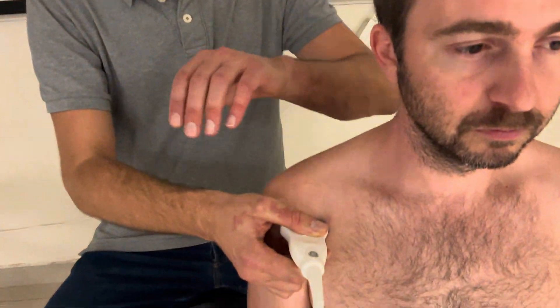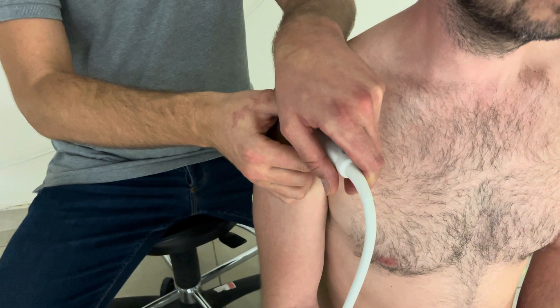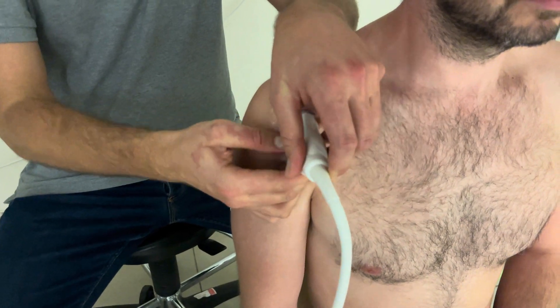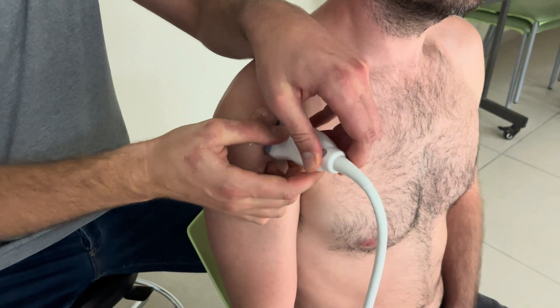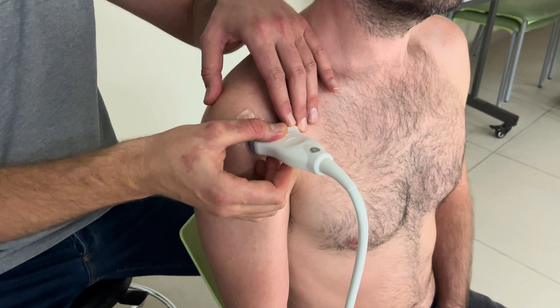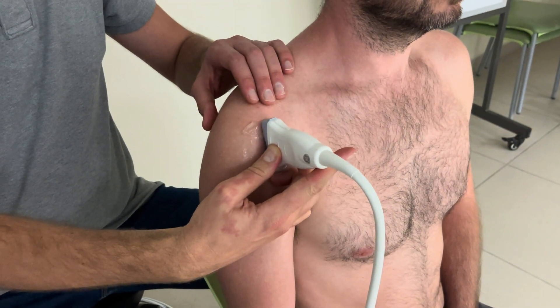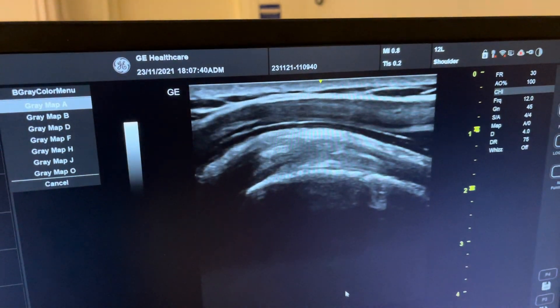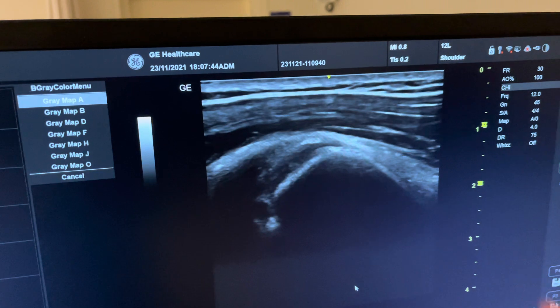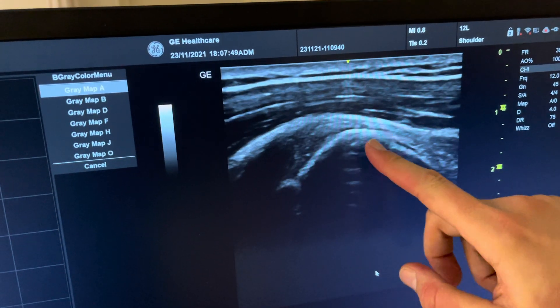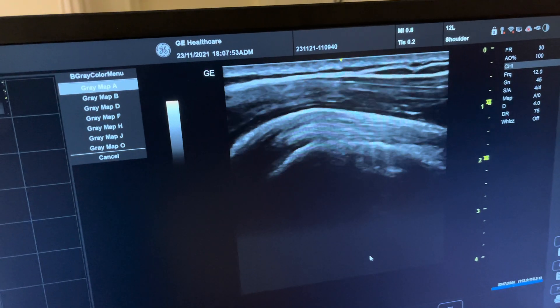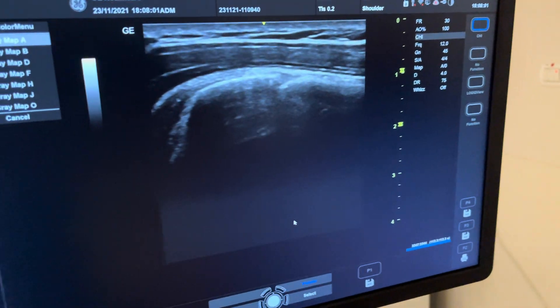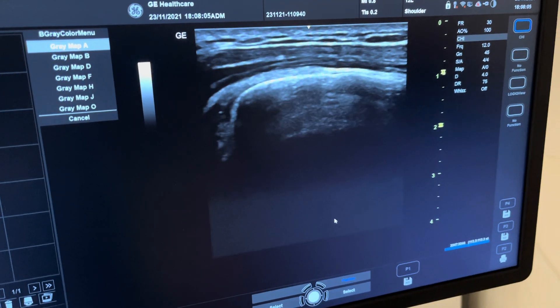Now we're back inside the intertubercular groove and we want the long axis view of the biceps tendon. You can take the middle of the probe and rotate it to the long axis, but that's a difficult technique. A simpler approach: place the probe in the long axis and move it first medially, then laterally to identify the bony contours. Going medial, you'll see a very clear, pointy protuberance — the lesser tuberosity — like a pointy mountain.